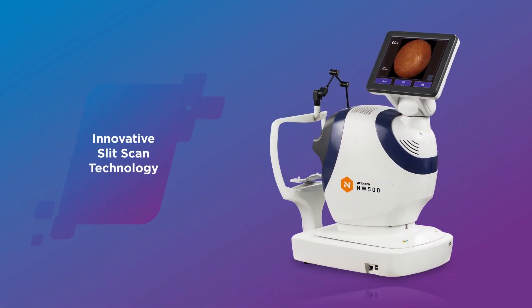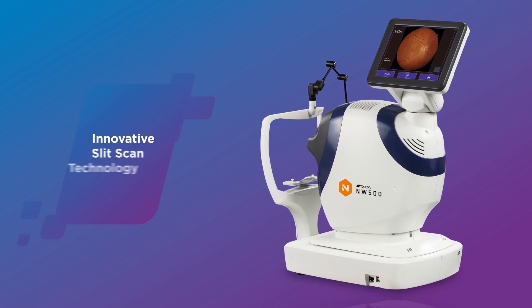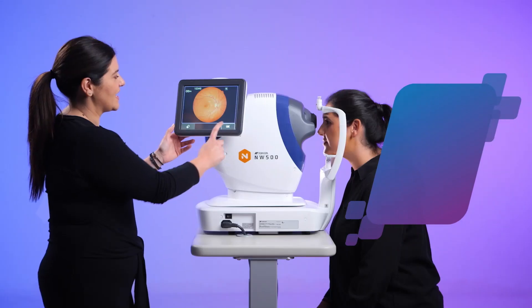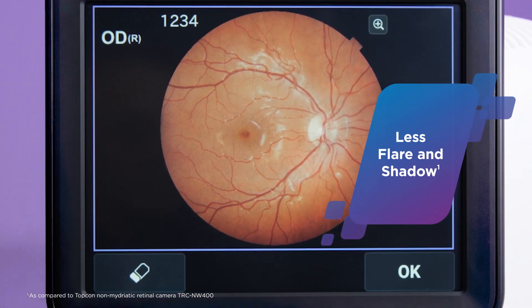The innovative slit scan illumination and rolling shutter mechanism in the NW500 make it possible to obtain excellent quality color fundus images with less flare and shadow.